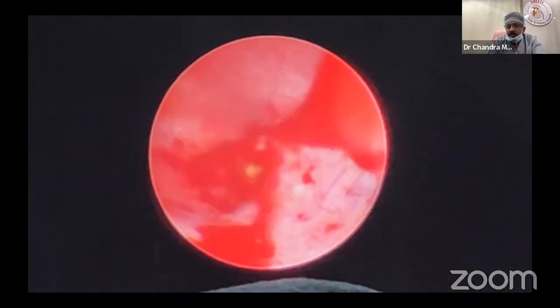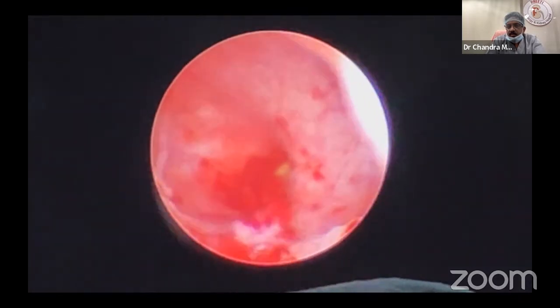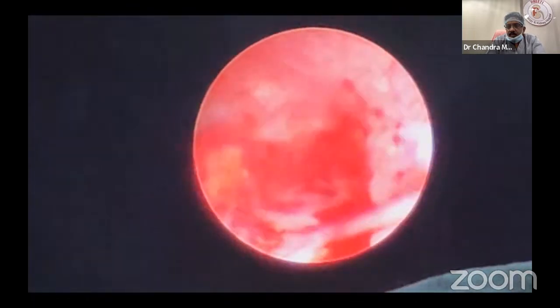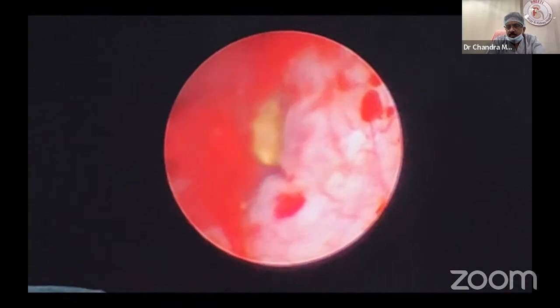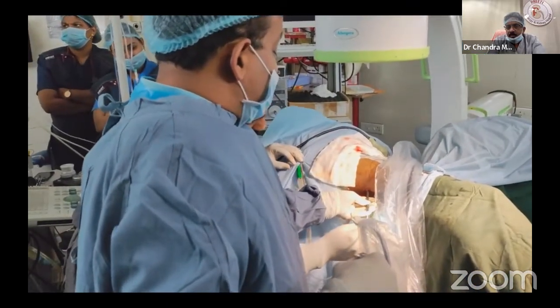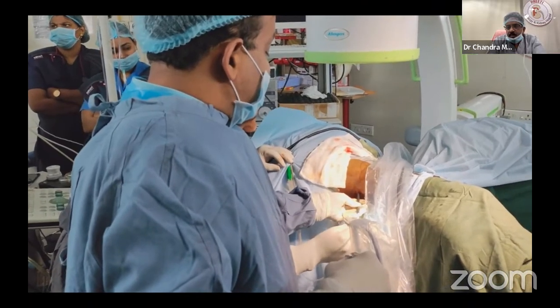Yes, sir. In children, the calyceal cup will be very small. You will just see this. If you come back, it will be outside, so you are just lateral to the infundibulum. That is what was shown in the beginning from the periphery of the calyx. How do you manage pushing water? You can remove this by suction like this.